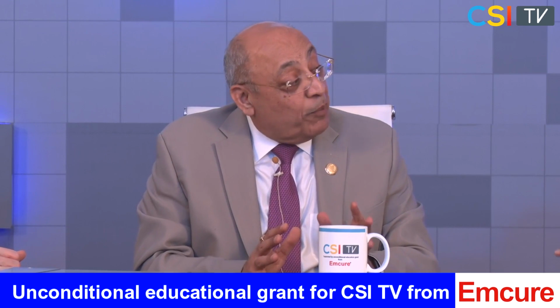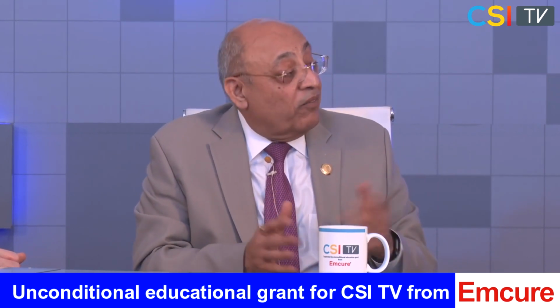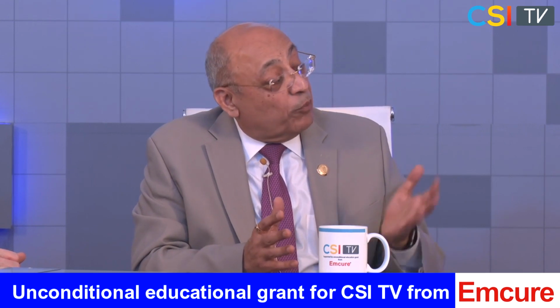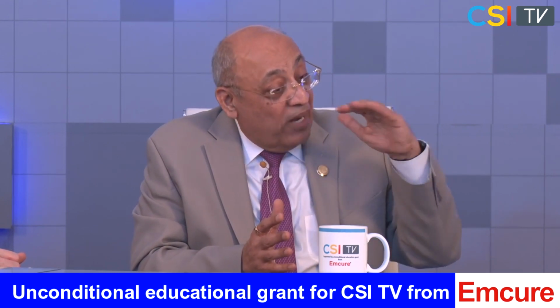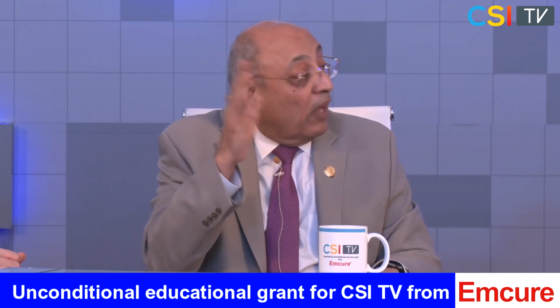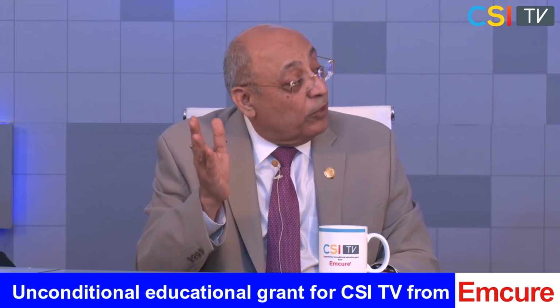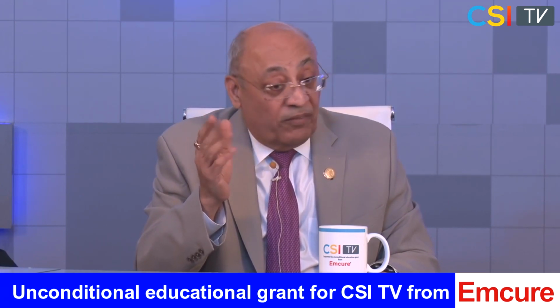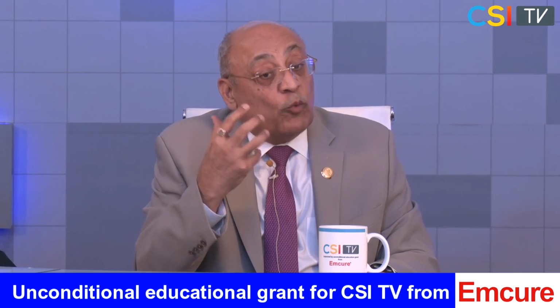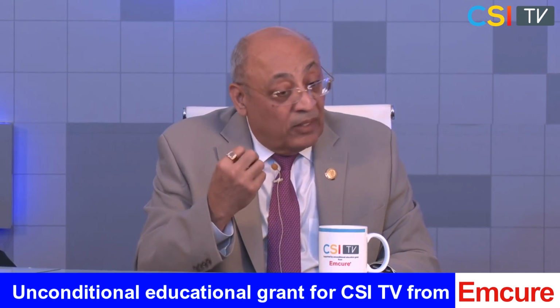Not that all the people who have an abnormal FFR are likely to have the event. The likelihood of an event is approximately 8%, so the positive predictive value would be in that range, while the negative predictive value was to the tune of 2 per 1,000, in the sense that 2 people will have an episode out of 1,000 people if you really had a negative FFR. So FFR brings us quite close to an ideal negative predictive value.